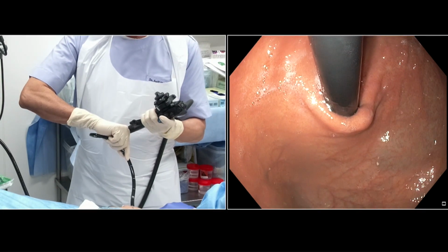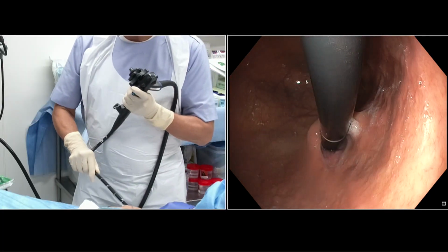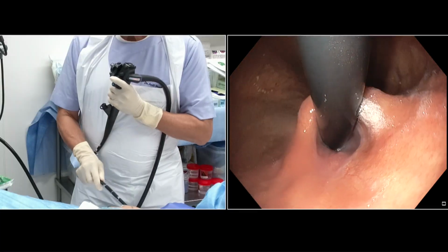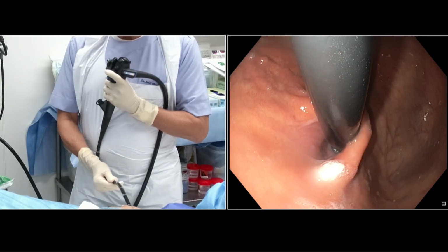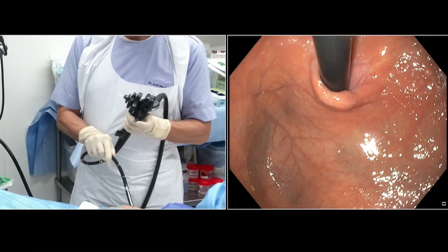And I can see the esophagogastric junction. You can know whether the OG junction is lax, whether this patient has hiatus hernia. You see here that the junction is slightly lax, but the scope gripping sign is very good. So this patient will not develop GERD. Not only that, you can see the angle of His is quite well preserved.